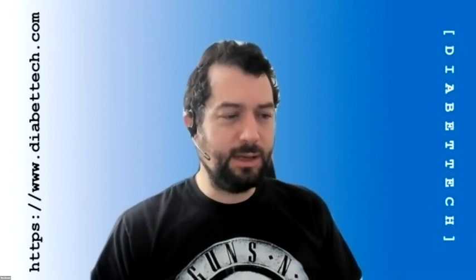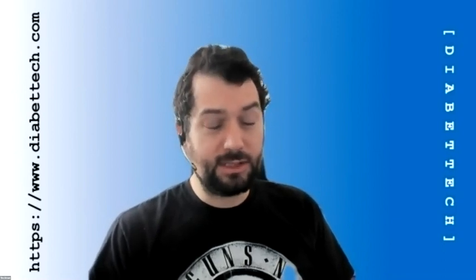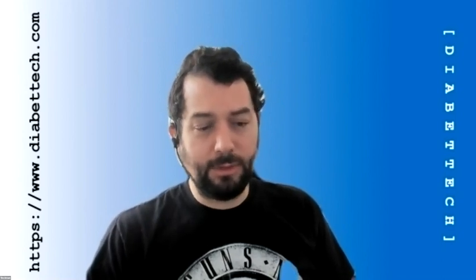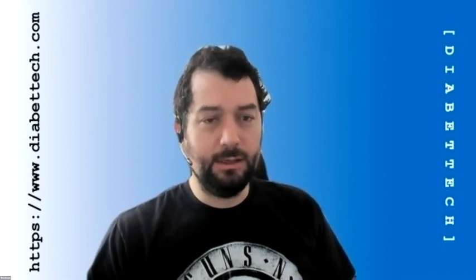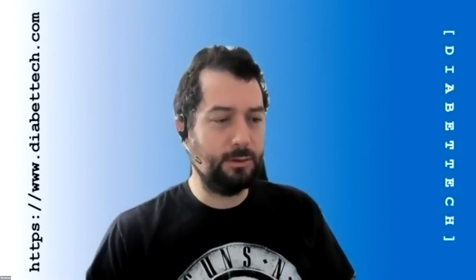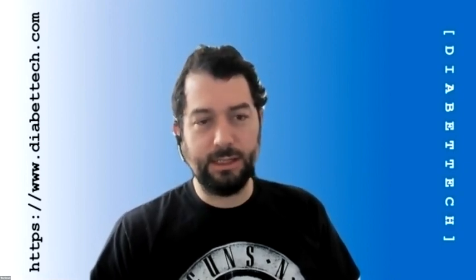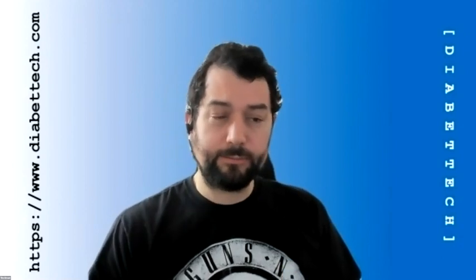Alex has mentioned free APS. Does anybody use it? I don't think we've got any users here using free APS. I think I've used the auto bolus branch, but it's not quite the same. I know Melissa Holloway, who's not on with us today, uses the free APS version. Some of the key things in that are the ability to use the variable carb absorption models, and also the adjustment of the amount of insulin that the system can give you as a percentage of basal rates and things like that. Thanks, Tim.